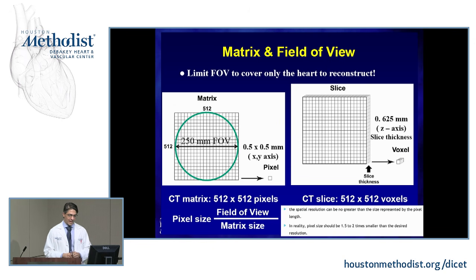This is a slide I won't spend too much time on. In the end, when you have to project your images on a screen, pixel size becomes very important. That is dictated by your field of view. Your matrix size is generally fixed at 512 by 512, so we really want to make sure that you cone down to the heart and that you're using around a 250 millimeter field of view.